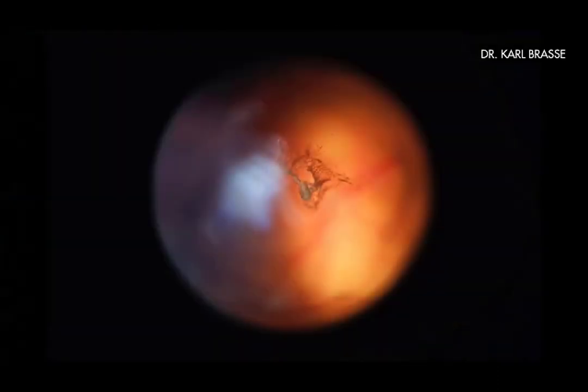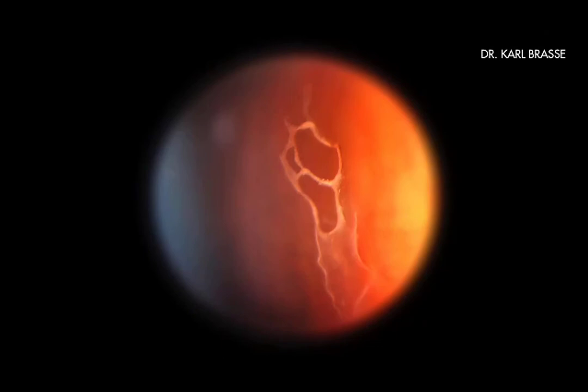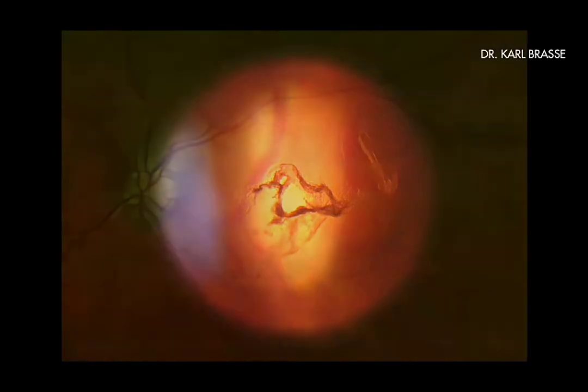Here you get to see three different Weiss ring formations which have been torturing the patients. They belong to group 2 and originate histoanatomically from the detached posterior vitreous membrane. The prognosis for laser treatment is excellent in this group.